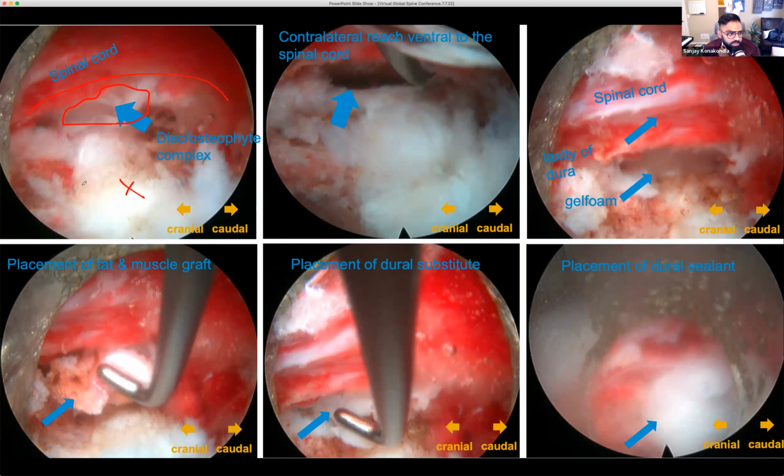we like to follow this river of disc space centrally, because here's the superior end plate and here's the inferior end plate. And when we follow that, if it follows this line, anything from here up is going to be a herniation. It's going to be outside of that area of disc space between the vertebral bodies. So whatever's higher than that, we're thinking shouldn't be there. And we can always see this bowing of the spinal cord there.